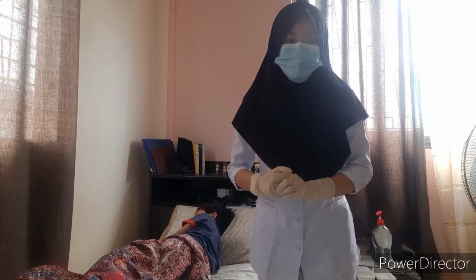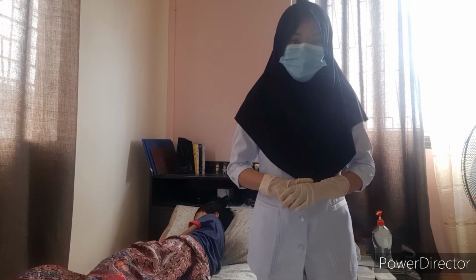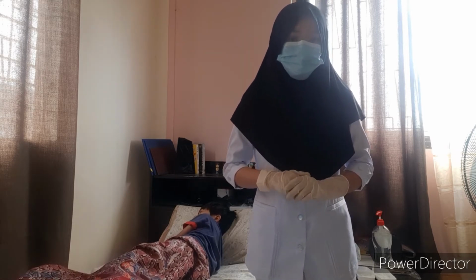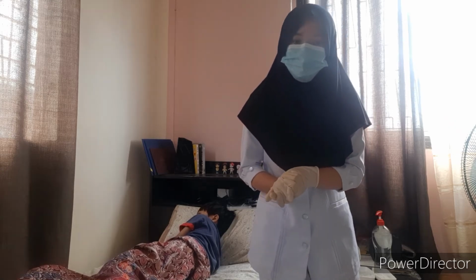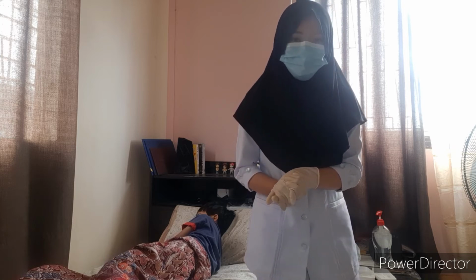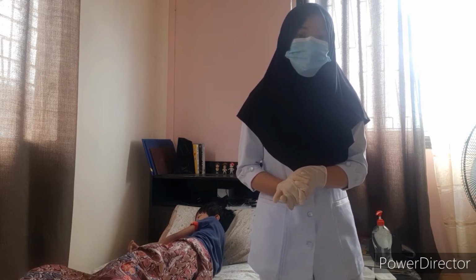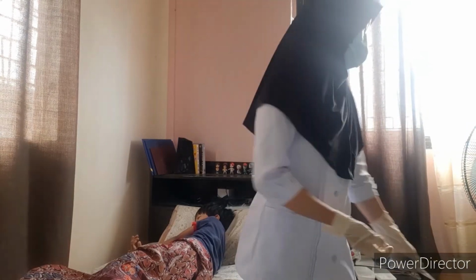So before inserting a digital thermometer into the anus, make sure to lubricate it with some water-soluble jelly first. The lubrication is typically placed over the probe cover to allow for easier insertion and increased comfort. So to reduce the friction and facilitate insertion without irritating the mucous membrane.